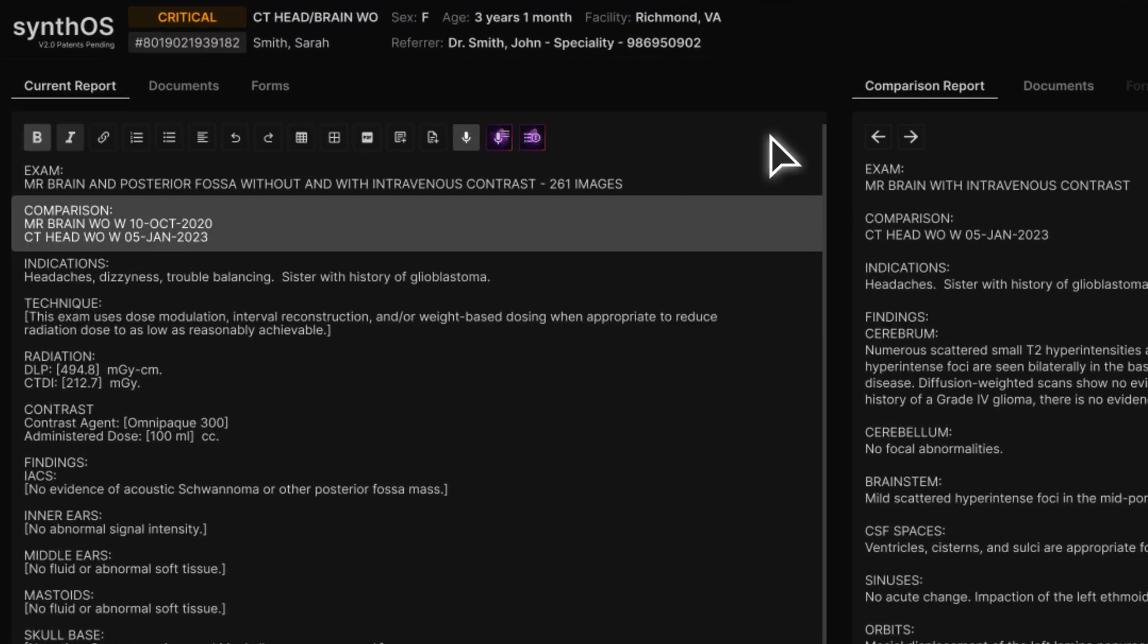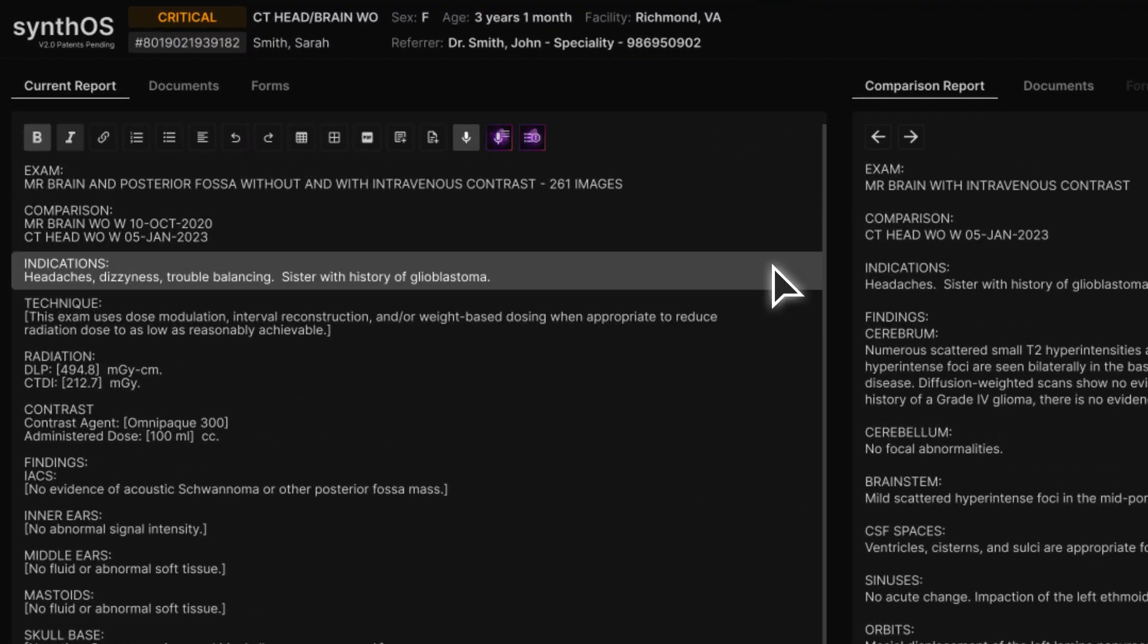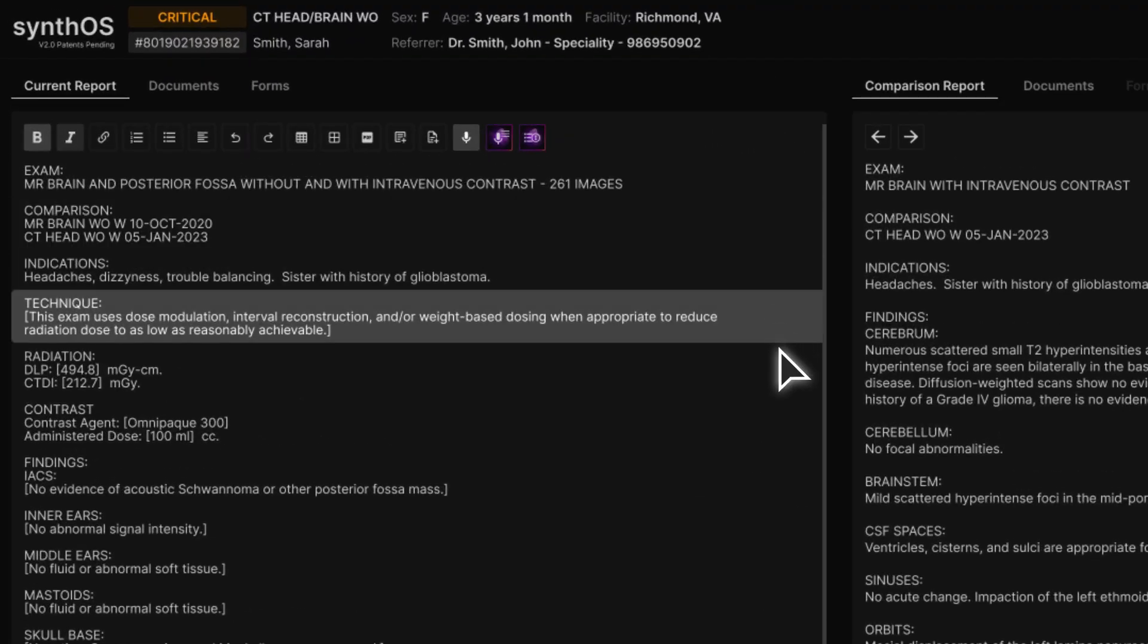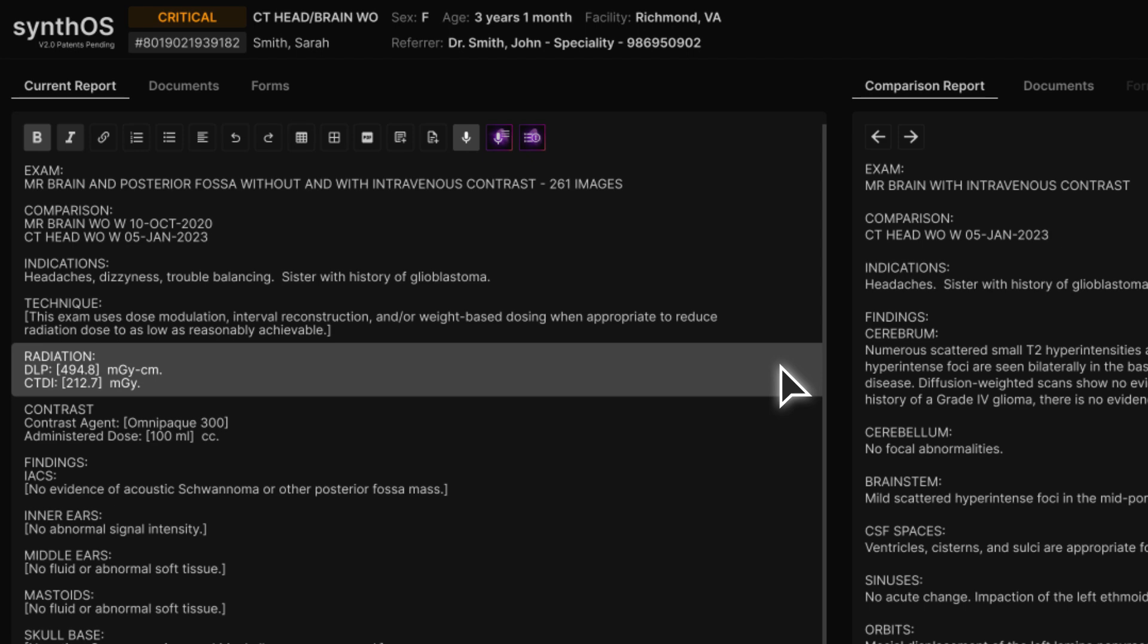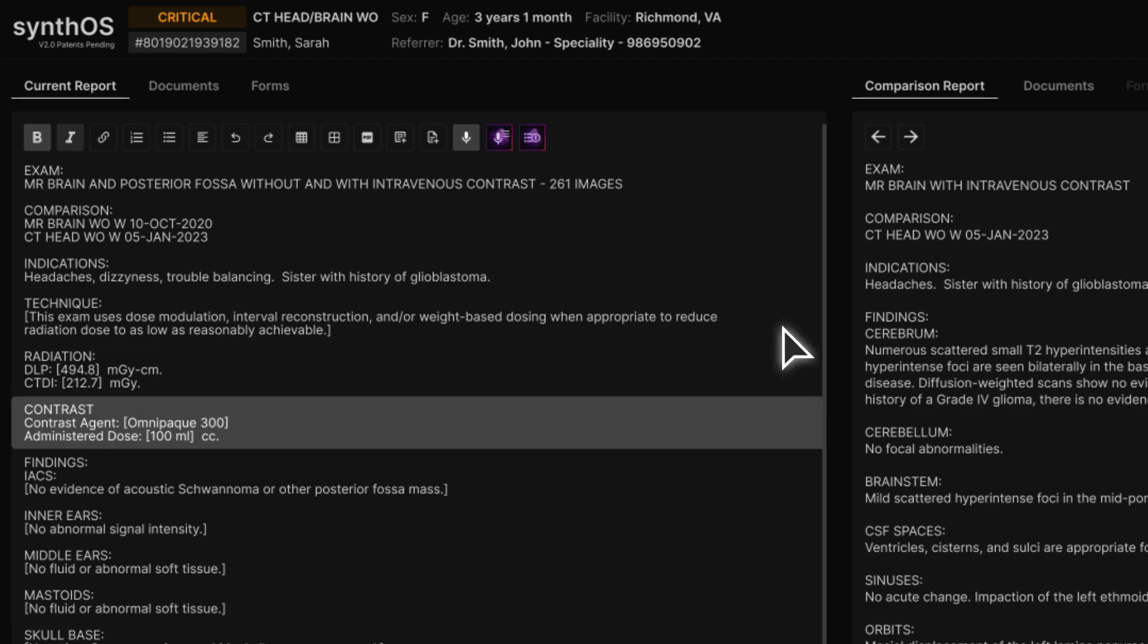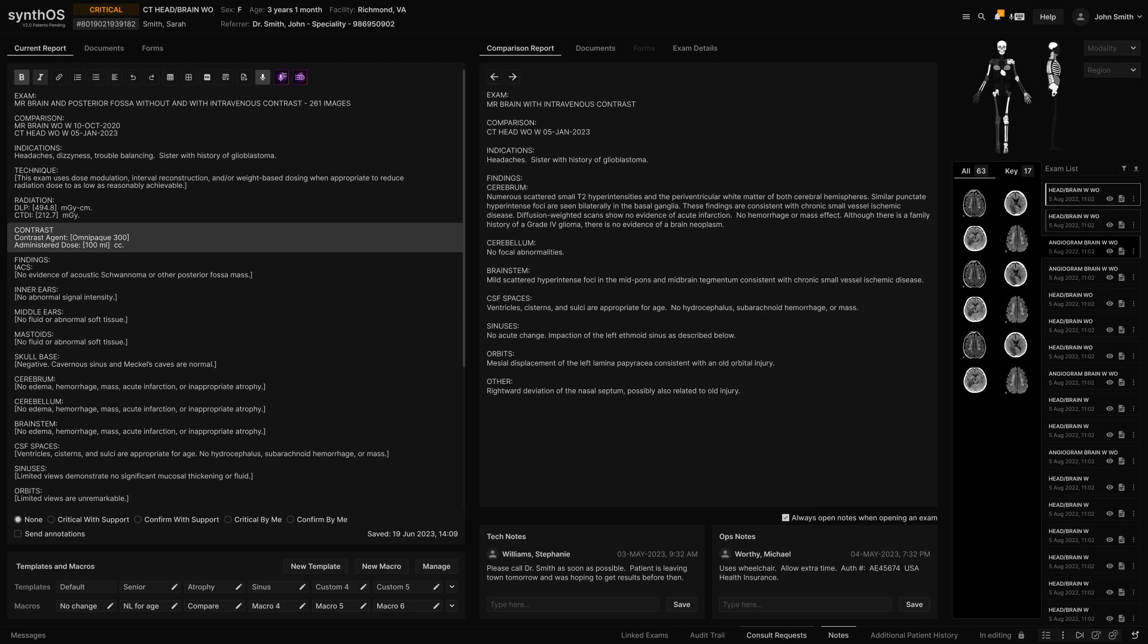The comparison exams, indications, technique, radiation dose, contrast details, or other desired information is automatically input into your report.